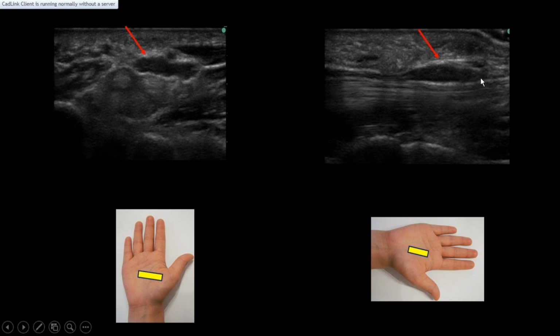In longitudinal section, you can see that the nerve is swollen, increased in caliber and hypoechoic. This is the area from where you would start seeing the nerve become thinned out and branch out into digital nerves, but here we see a sudden enlargement. Later on, this was confirmed to be an intraneural fibroma. So there is value in following the nerve at least a few centimeters distal and proximal to the site where you're suspecting the compromise.